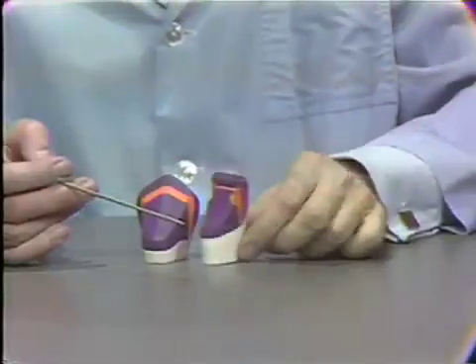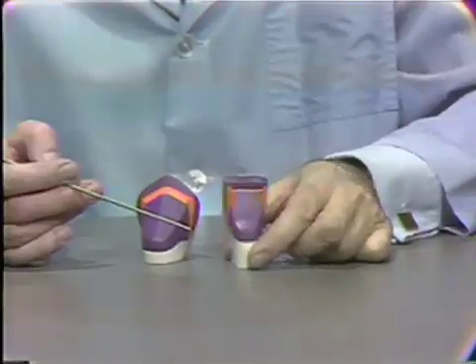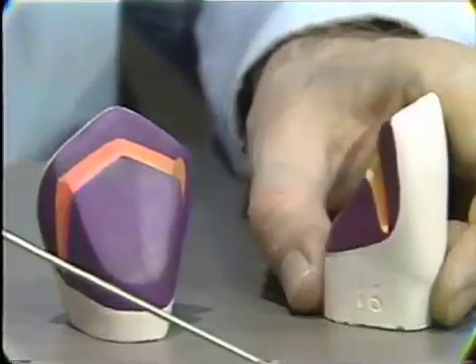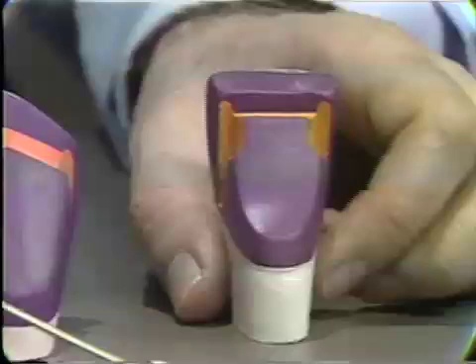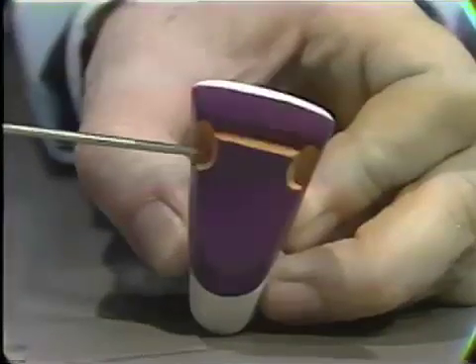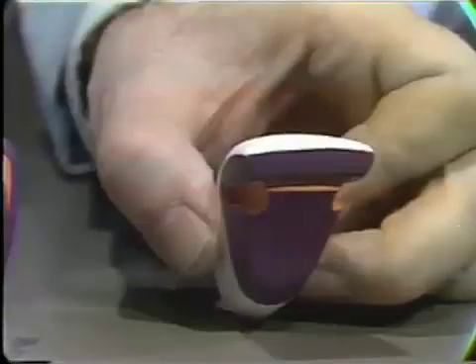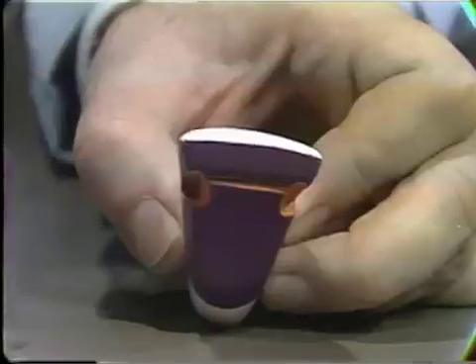The three-quarter crown varies a little bit according to the shape and character of the particular tooth. Here is one done on a mandibular incisor, which creates just a slightly different picture in the finished preparation. This particular one has grooves cut a little more extensively and made so as to be sort of retentive in themselves. They're rather key-like, as I think you can see in that cross-section, so that they're additionally retentive from that point of view.